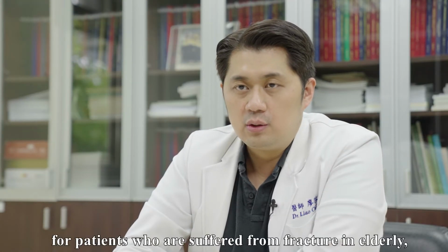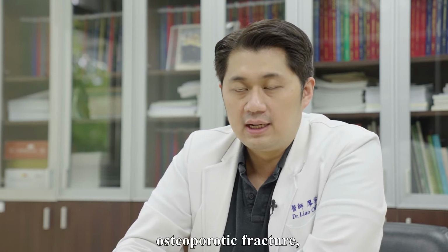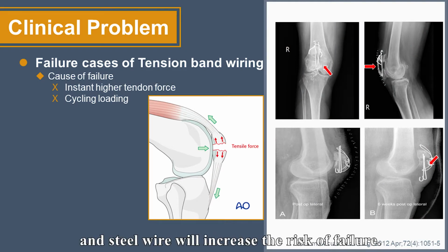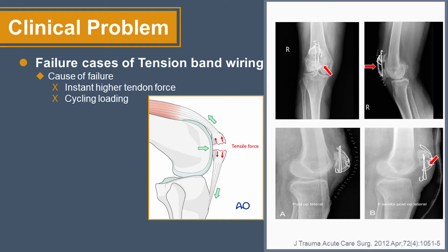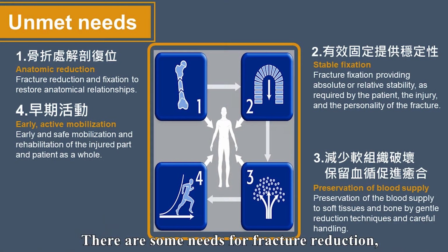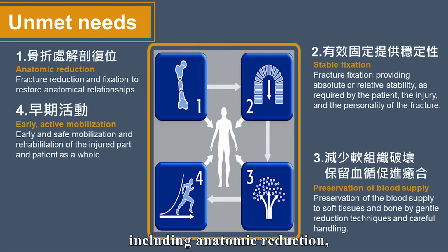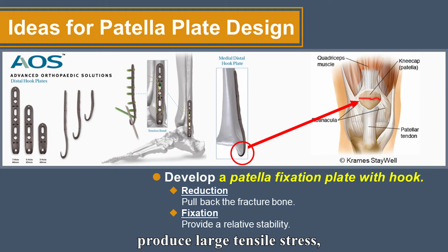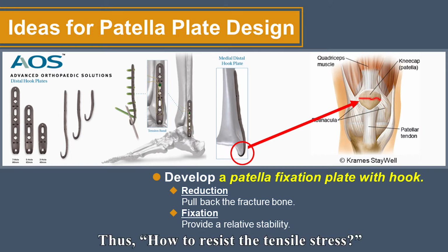However, for elderly patients who suffer from fracture, osteoporotic fracture, or comminuted fracture, winding the patella with steel needle and steel wire will increase the risk of failure. What's worse, the patient has to undergo a second surgery. There are some needs for fracture reduction, including anatomic reduction, stable fixation, preservation of blood supply, and early mobilization. The quadriceps tendon and patellar tendon produce a large tensile stress, leading to more displacement when a patella fracture occurs. Thus, how to resist the tensile stress has become a clinical problem.